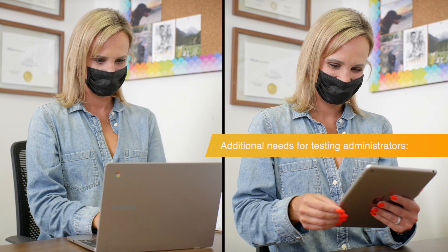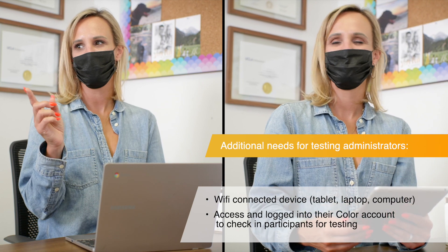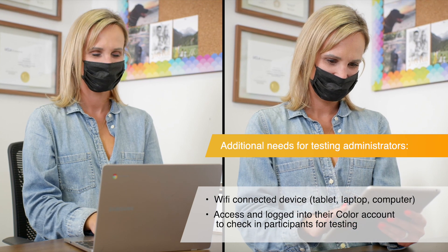In addition to the testing station, the testing administrator will also need a Wi-Fi connected device, such as a computer or tablet, to access their COLOR account and check in participants for testing.